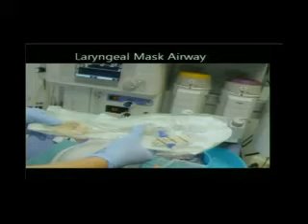This is an invention just within the last about 15 years. And what this does is it doesn't go into the trachea. Instead, if I may use my laser pointer here, this right here is a soft rubber portion. And that goes in the back of the throat, but it wraps right around the larynx where the vocal cords are, so that everything is pushed out of the way. So you don't actually have to go into the windpipe itself.